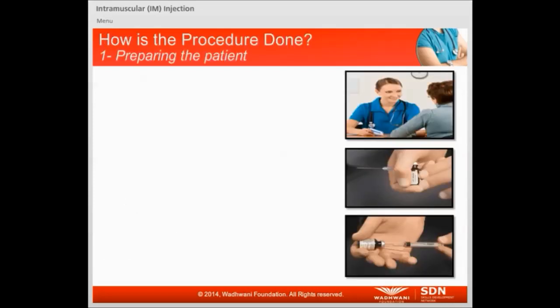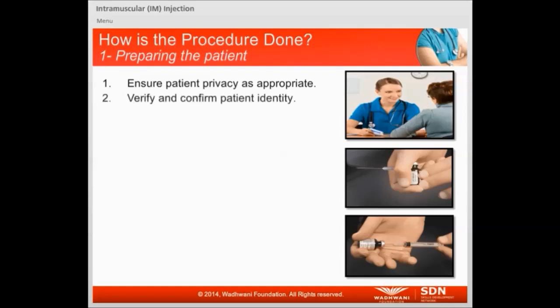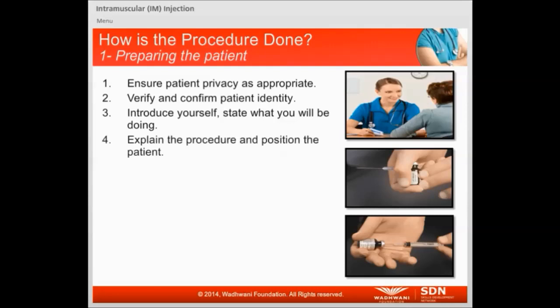Now let's take a look at the procedure to administer an IM injection. 1. First, ensure patient privacy as appropriate. 2. Then verify and confirm the patient's identity. 3. Introduce yourself and state what you will be doing. 4. Explain the procedure and position the patient properly.